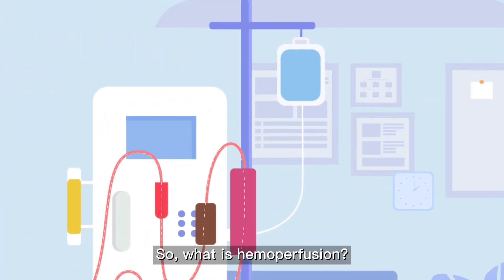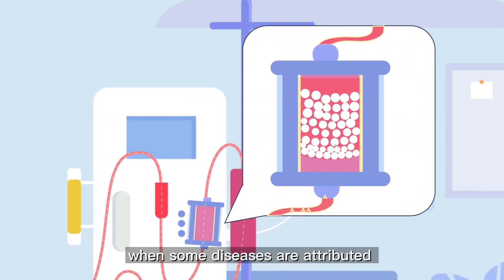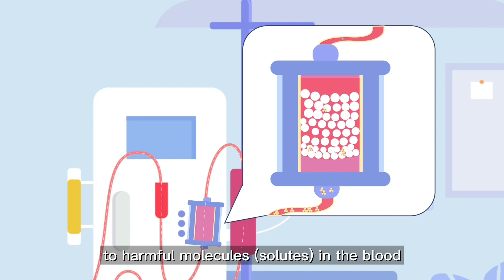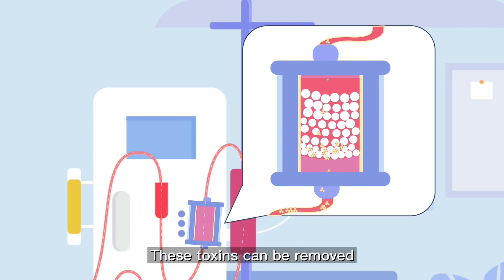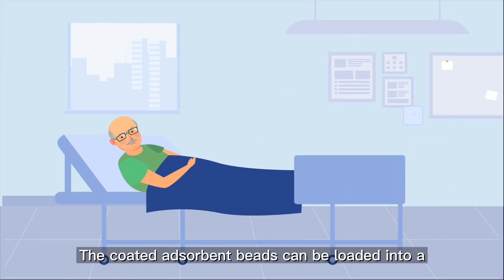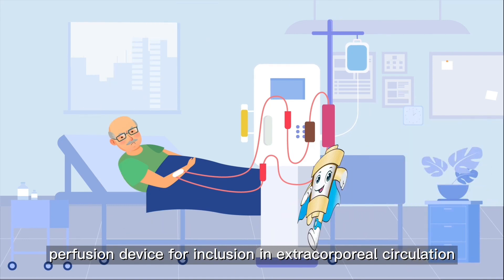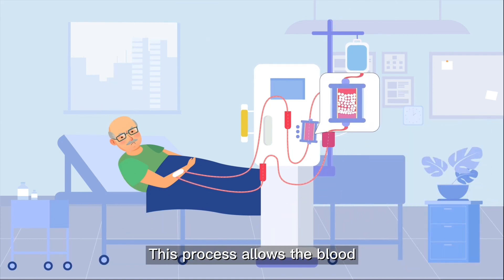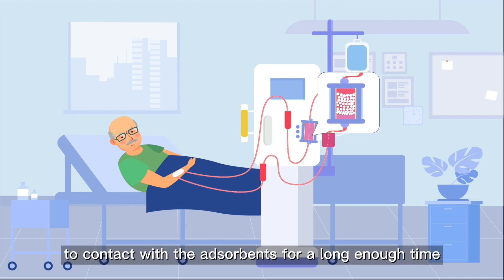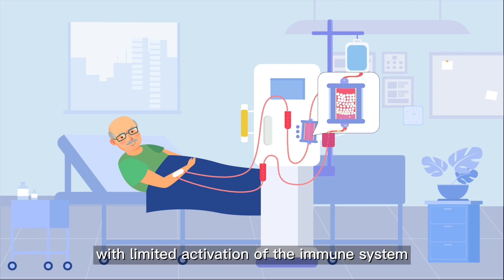So what is hemoperfusion? That is, when some diseases are attributed to harmful molecules — solutes in the blood — these toxins can be removed by absorption via absorbent beads. The coated absorbent beads can be loaded into a perfusion device for inclusion in extracorporeal circulation. This process allows the blood to contact with the absorbents for a long enough time to remove harmful solutes with limited activation of the immune system.